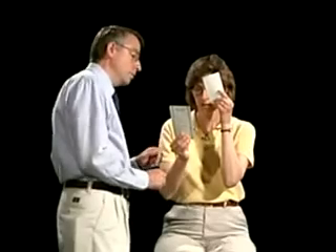Now go ahead and switch eyes. You've got to go ahead and hold the card — which line can you read? The smallest one again. Okay, go ahead and read those numbers. 4, 2, 8, 7, 3, 9. Very good.